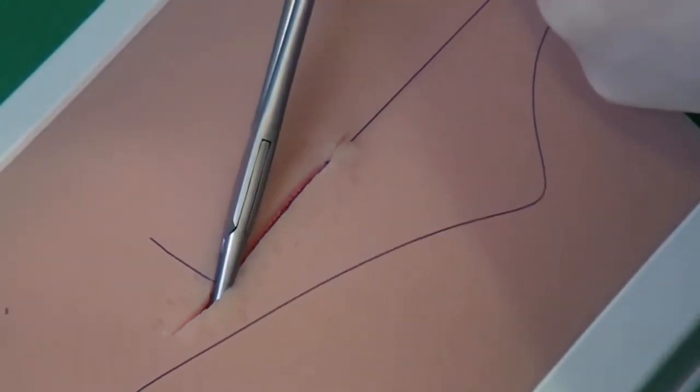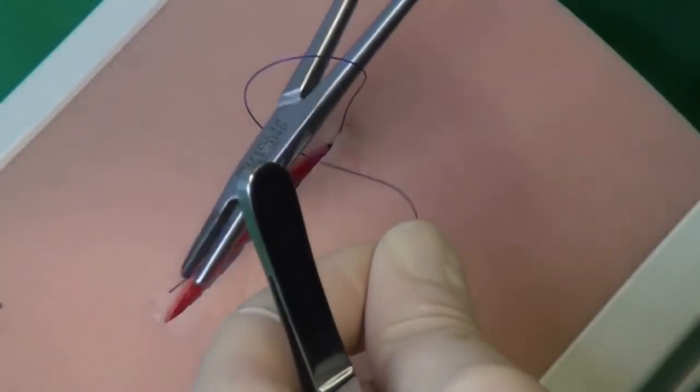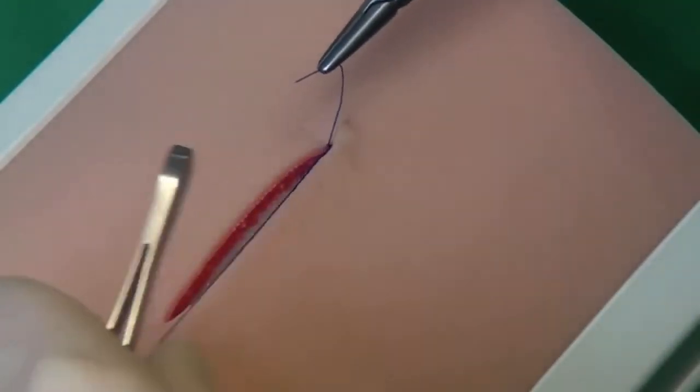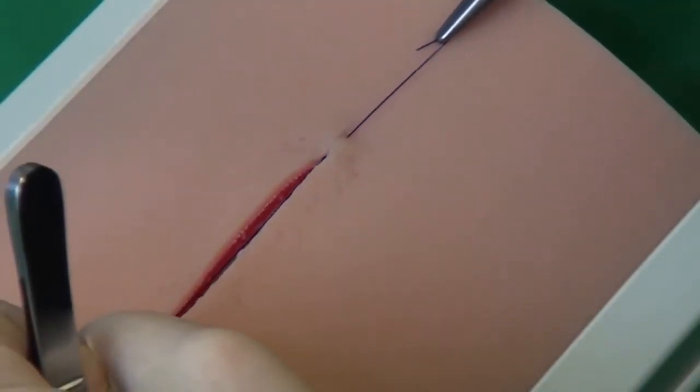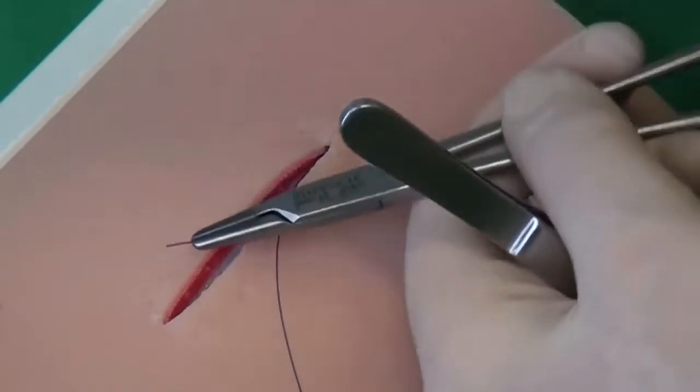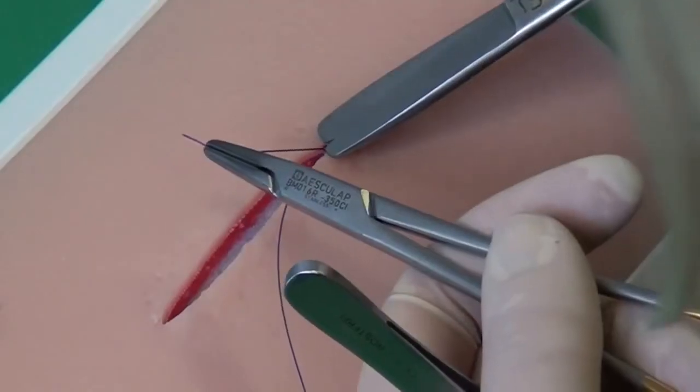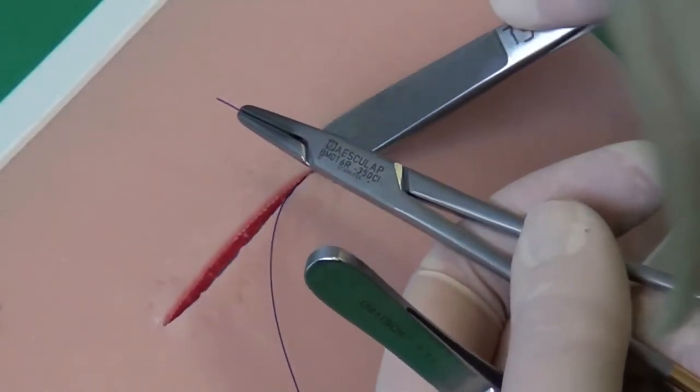Right-handers suture from right to left, with the needle holder in the right hand and the left hand holding the forceps. The end of the thread is cut short so that it stays inside the skin.